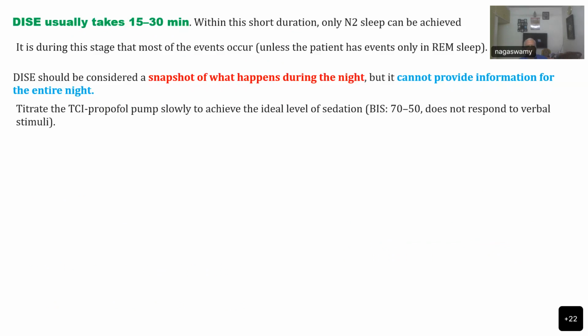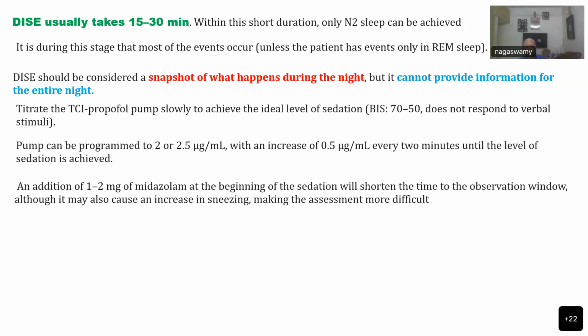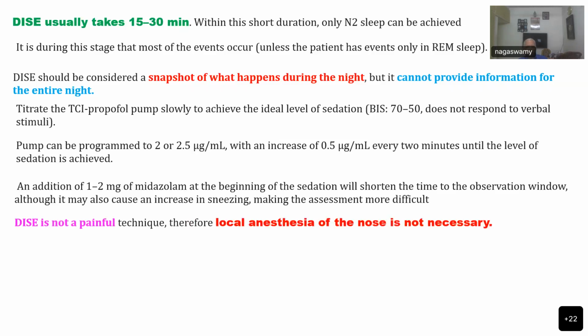The TCI propofol pump can produce an ideal level of sedation by correctly injecting the dose in a continuous fashion, instead of our manually pushing the drug at various doses. And if you add midazolam, maybe we can shorten the duration of the observation window. The only problem is that sometimes it may cause sneezing, making the assessment more difficult.